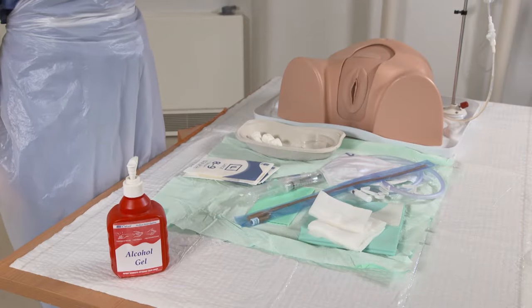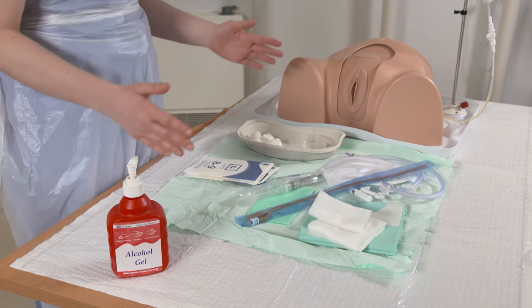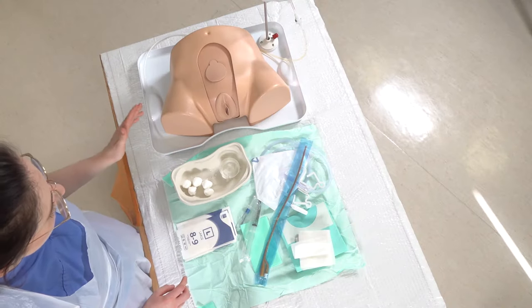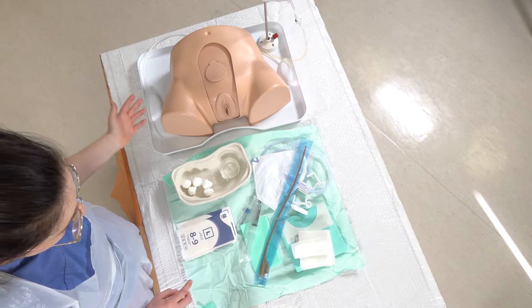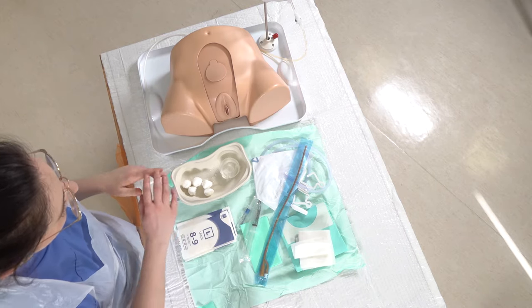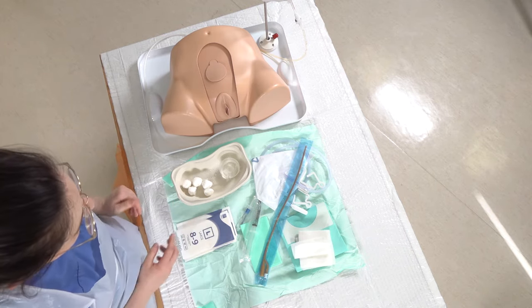So today we're going to be doing female catheterisation. We've got our sterile trolley set up ready with all of our equipment. In terms of patient position, we need to put them on their backs, legs and hips bent, knees bent, and then place their knees apart so we can get access.